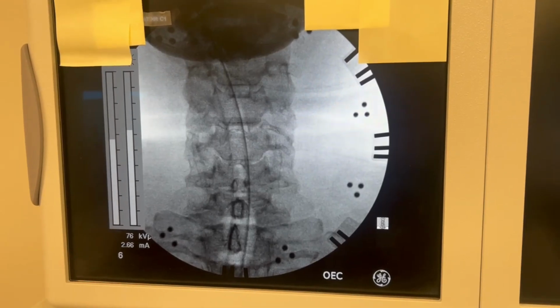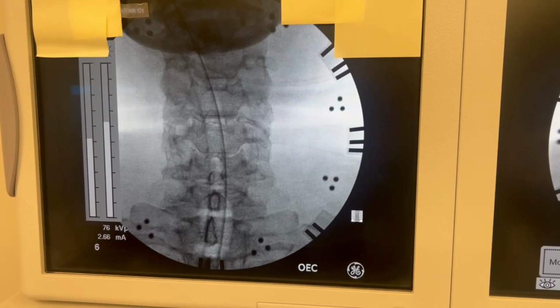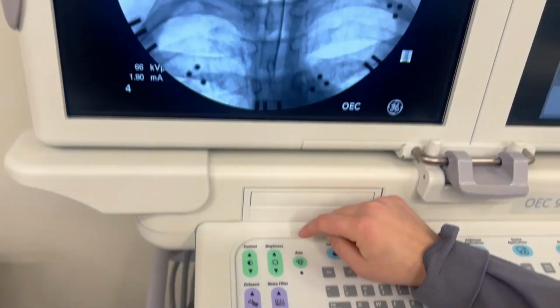Auto contrast is the default contrast used for that specific anatomic structure. The up and down arrows are used to adjust the contrast to increase or decrease the brightness of the image.